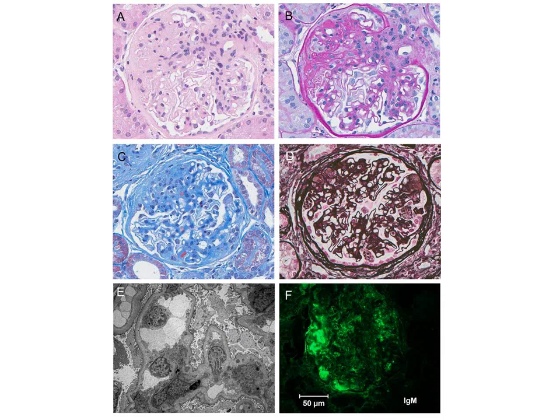So seeing this kind of arrangement of podocyte cytoplasm is not abnormal in a regular diagnostic specimen. Sometimes it'll be extremely swollen and you can't even see urinary space at all, and all you see is podocyte cytoplasm. To me, when it's that swollen, I think it's indicative of podocyte injury, but we do have evidence of podocyte injury with that foot process effacement.